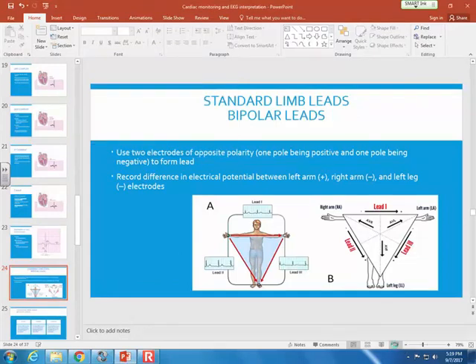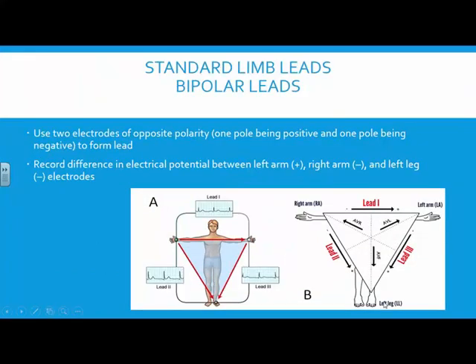We're going to, for just a few minutes, take a step off of waveforms, all that stuff, and talk about exactly what's the science behind monitoring. This is to hopefully help you understand what you're looking at when you look at a waveform. And it all has to do with the leads.